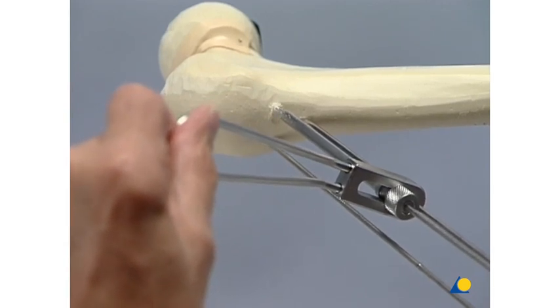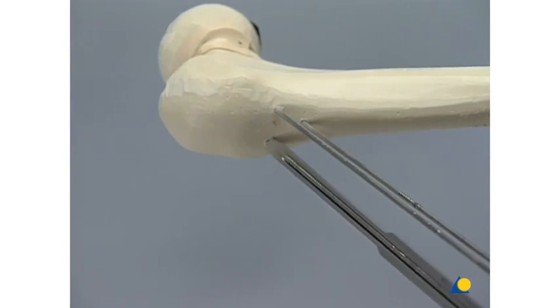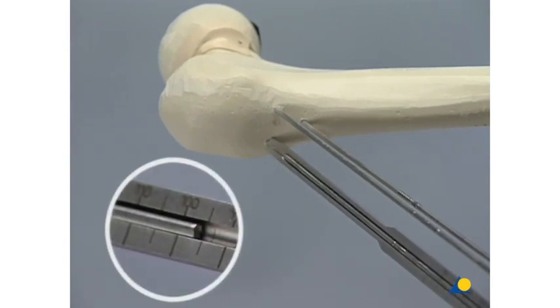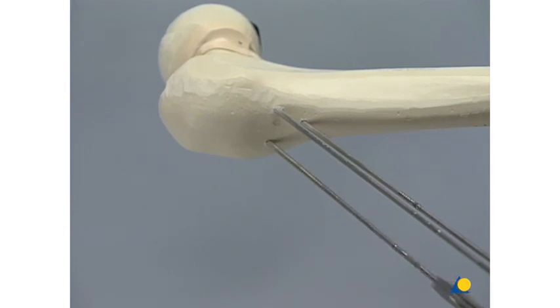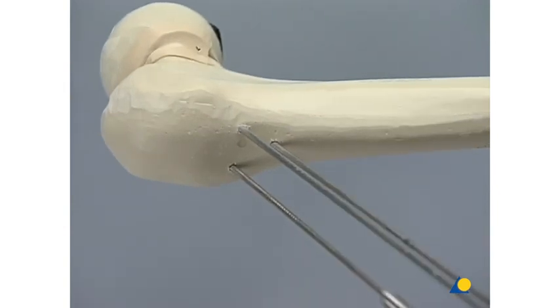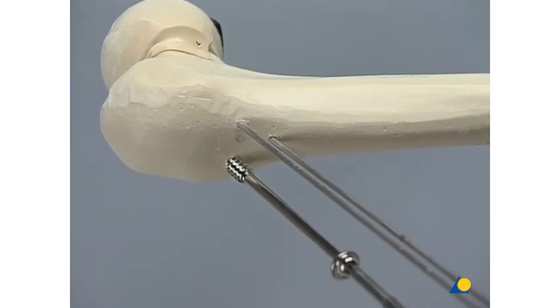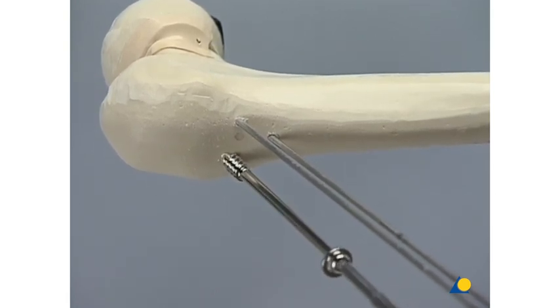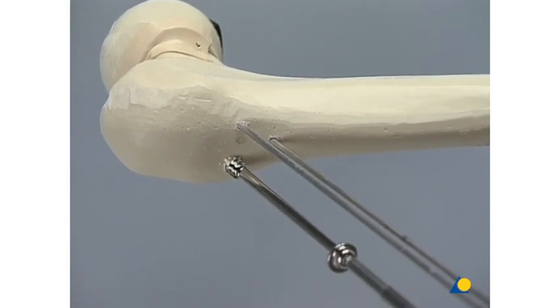Measurement of the screw length using the direct measuring device. The new self-drilling and self-tapping 7.3 millimeter screw can now be inserted with the cannulated screwdriver. Only in very hard cortical bone will it be necessary to pre-drill the near cortex with a 4.5 millimeter drill bit.